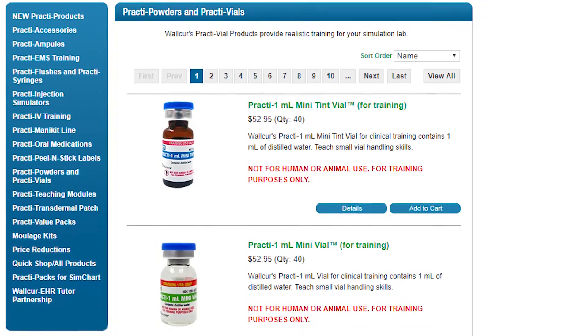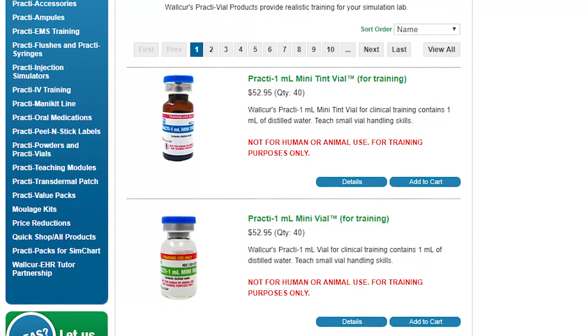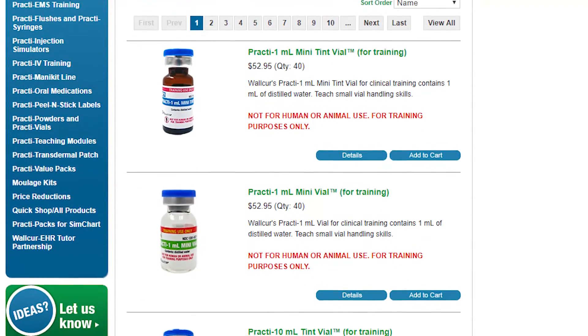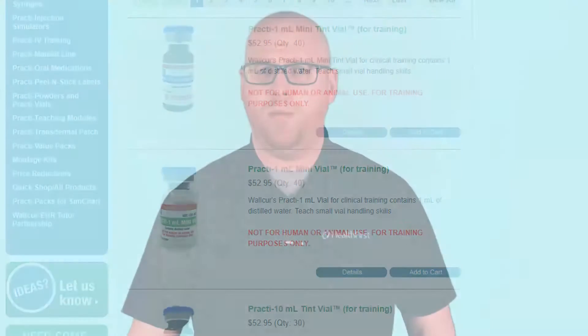In this video, we will describe the process of drawing up epinephrine from a vial and from an ampoule. The best practice, as stated by both Dr. Malamed and the ADA, is to use an epinephrine autoinjector in the event of anaphylaxis. But when one isn't available, the next best option is to be ready to use a needle and syringe for administration.